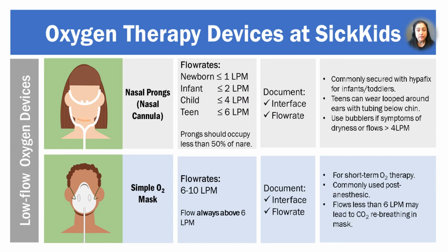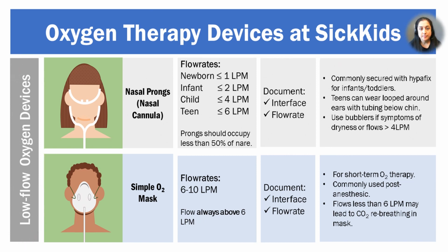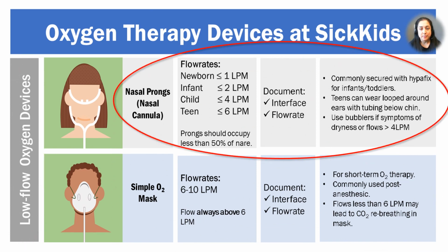Here are some low flow oxygen devices that we use at SickKids. These will be reviewed in the next few slides. These posters are also available in the community webinar section of the SickKids Connected Care website under resources. Let's look at nasal prongs first.